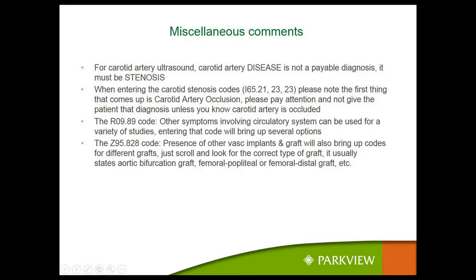It really is. And when he first started, there were several times he would see a patient in the office and call us and say, radiology says it's 70%. Can you look? I don't want you to do a full study, just look at that one segment and tell me, is it 70%? And sometimes he would say yes it is, and sometimes he would say no, it's not. Wow. And a lot of it is based upon the diagnostic criteria.